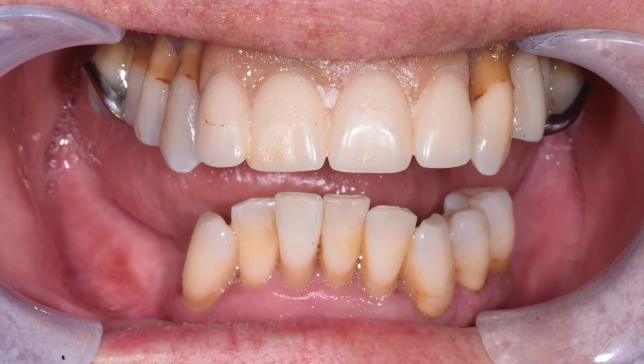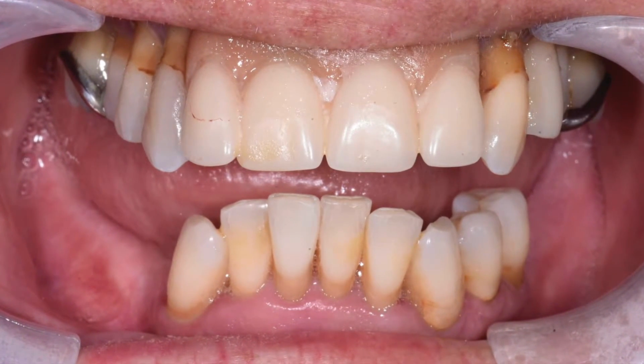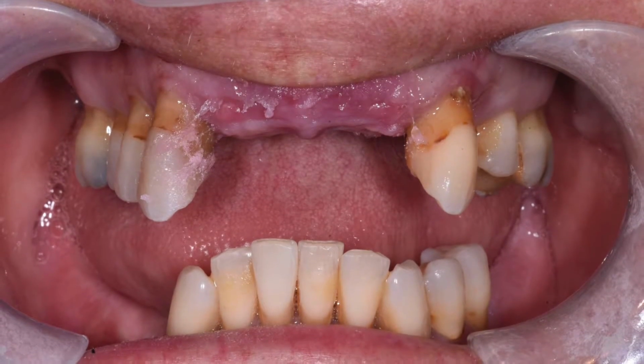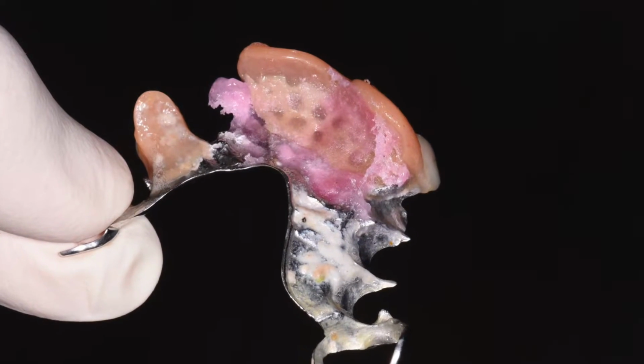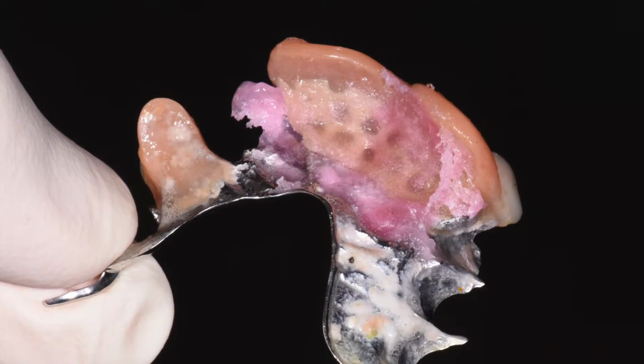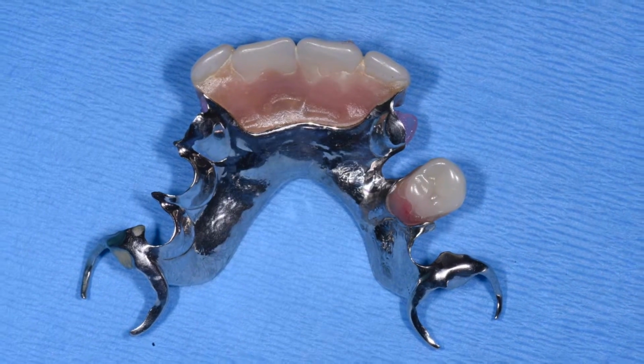When patients lose teeth, of course, they normally use a denture to replace the teeth, and in Kelly's case, you can see here she's been wearing a denture. It's been very loose, so there's a lot of adhesive just to hold that denture in place. So there's a bite compromise as well as an aesthetic compromise in this case.